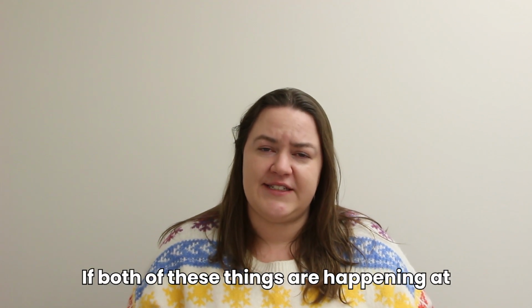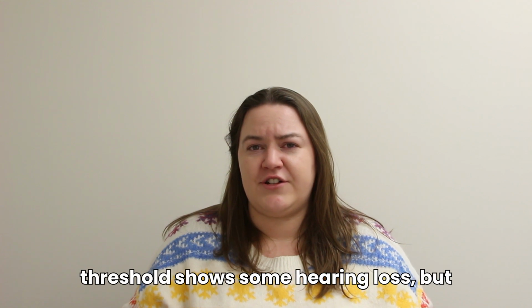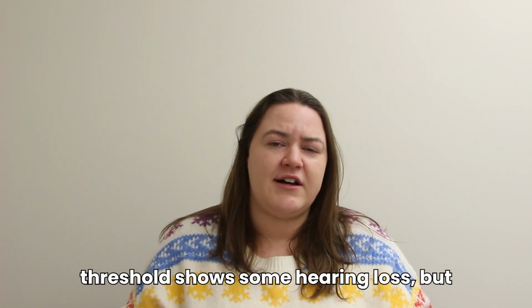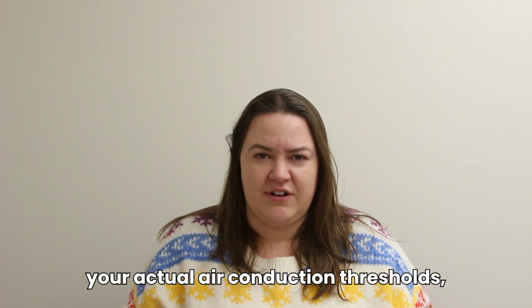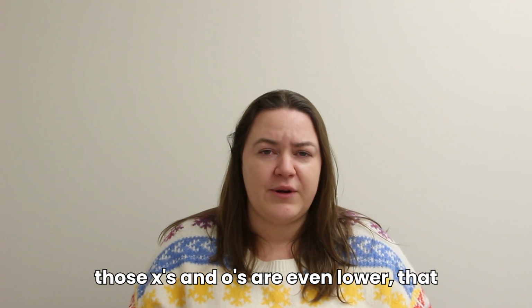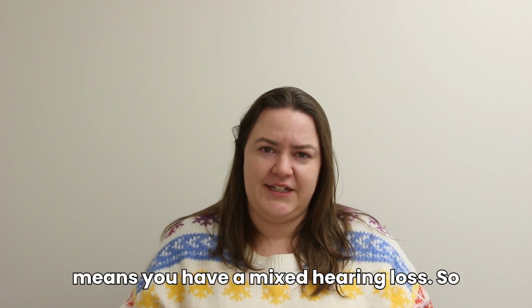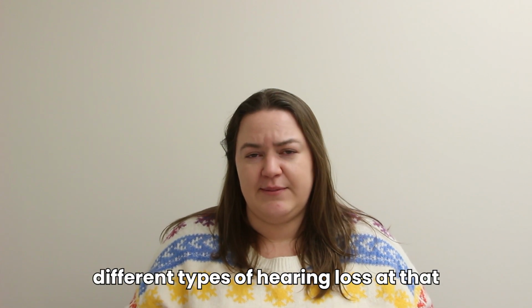If both of these things are happening at the same time, so if your bone conduction thresholds show some hearing loss, but you also have a gap where your actual air conduction thresholds, those X's and O's, are even lower, that means you have a mixed hearing loss. So it's a combination of at least two different types of hearing loss at that point.